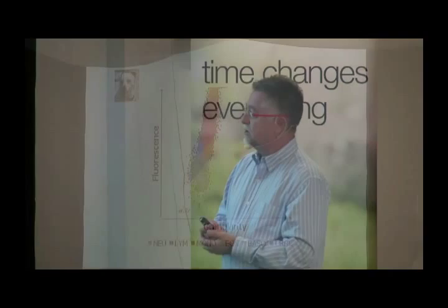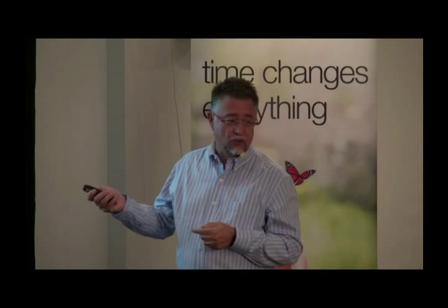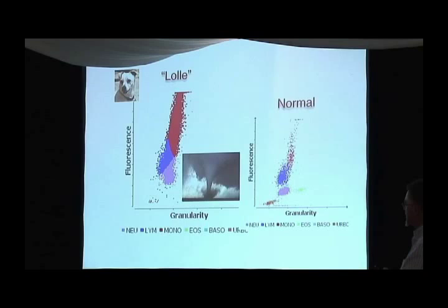Okay, so what do you think about this white cell dot plot? Are those good cells or bad cells? Bad cells, all right, because they widen towards the top. That's what we call a tornado cloud, and that's your typical acute leukemia dot plot. So you can diagnose acute leukemia from looking at that thing from the parking lot, all right? Very, very easy. So that's what we call the tornado cloud, as I was telling you. What do you think about the white count?